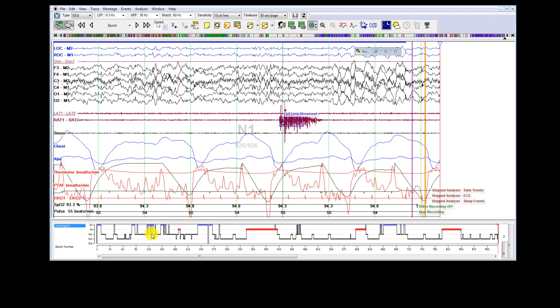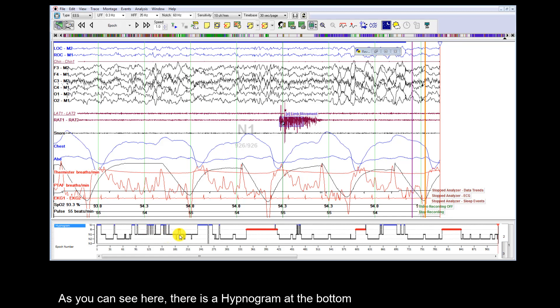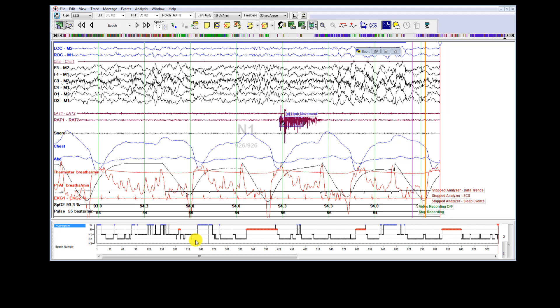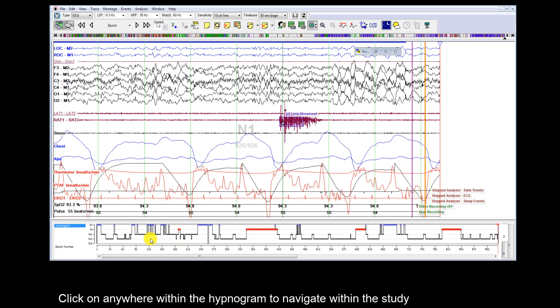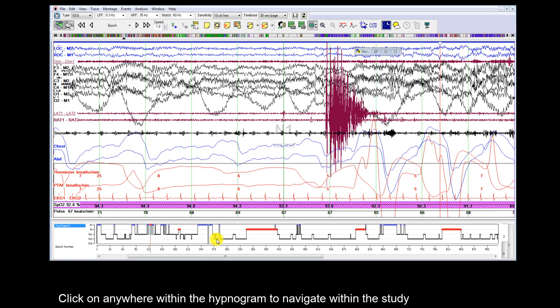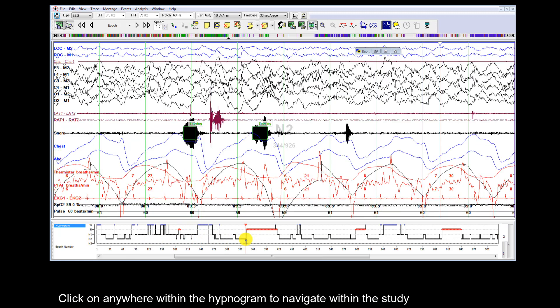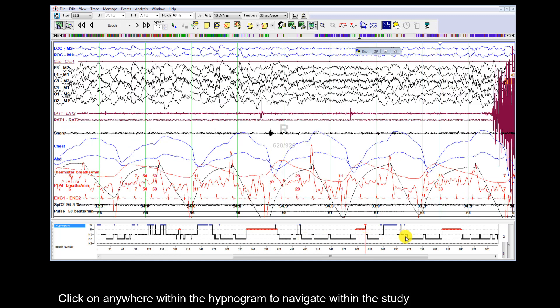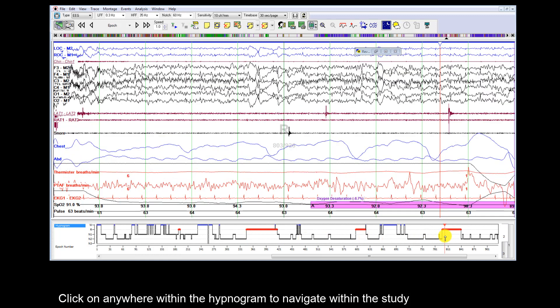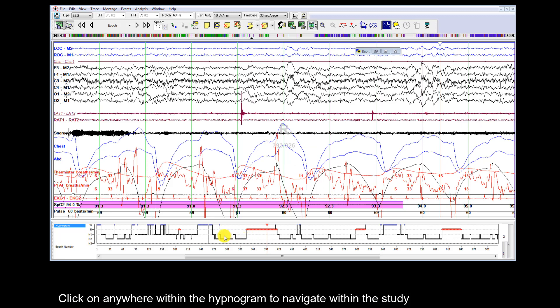As you can see here, there's a hypnogram at the bottom. Click anywhere within the hypnogram to navigate within the study.